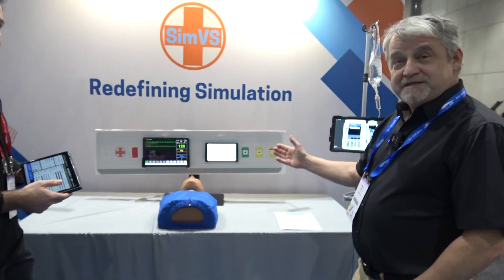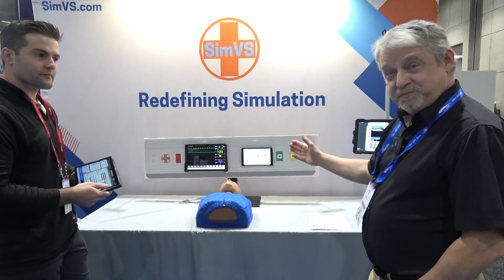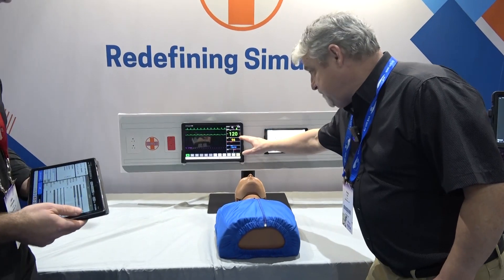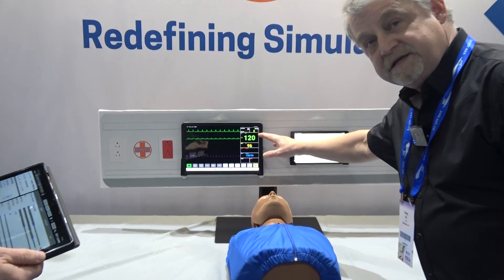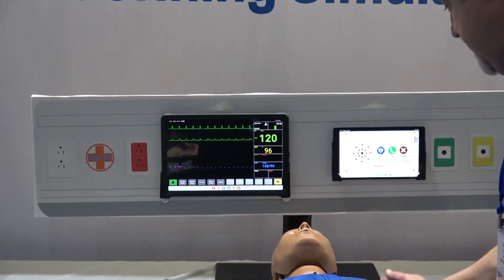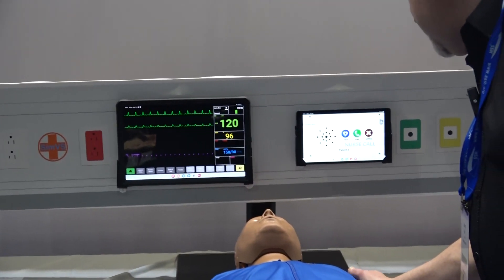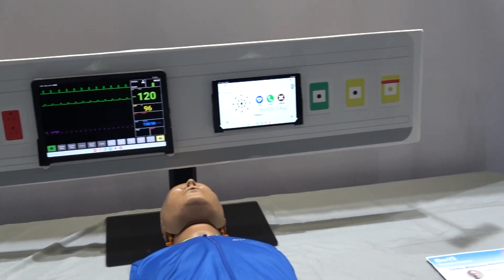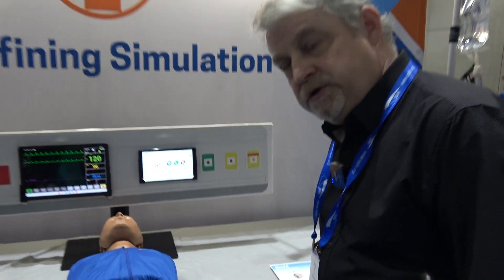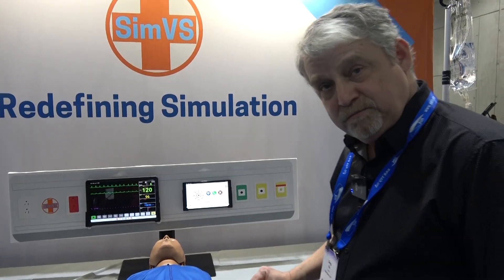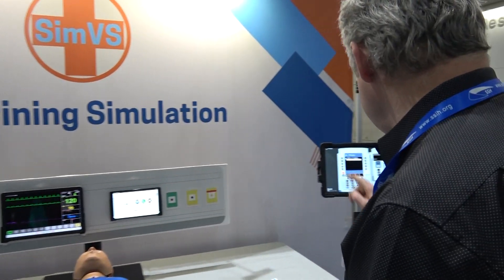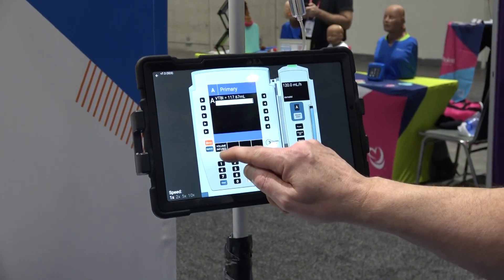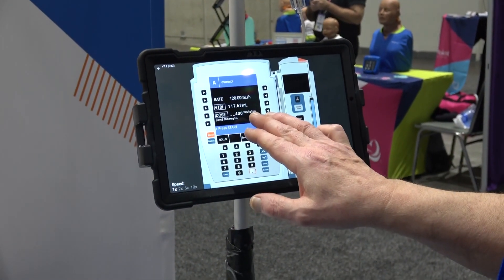Our nurse call system lets the provider know that there's a problem. They will come in, cancel the alarm, and take a look at the monitor — we can see that the patient is worse, tachycardic. I know that I have standing orders to increase the Esmolol, which I'm going to do right now. I'll come over to our pump and adjust the rate.